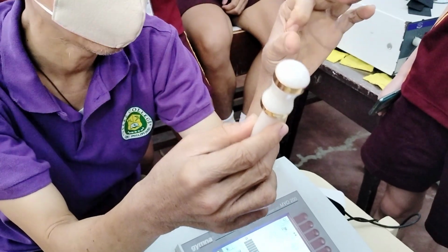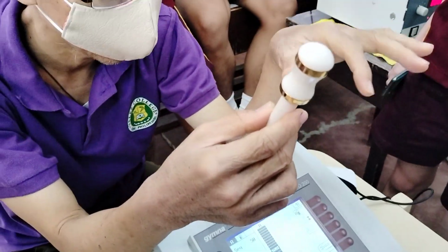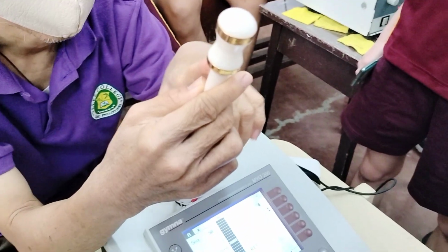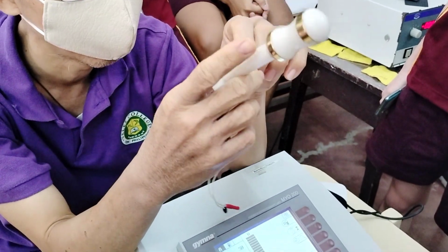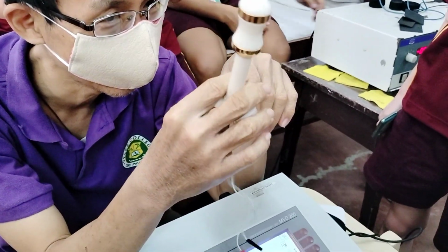You have your anal sphincter there, as I mentioned. This would be inserted into the anus. Of course, you have to ask permission. Sir, ma'am, I'm going to insert this. Would you allow me to insert this one? Alright.